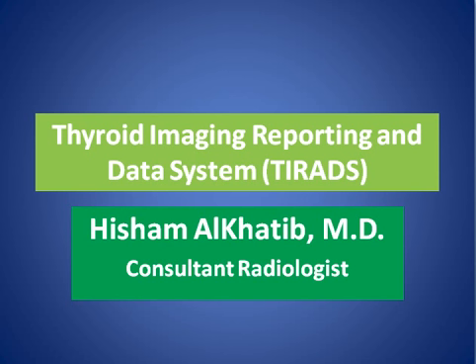My topic today is about thyroid imaging, reporting and data system, TIRADS, by ultrasound.